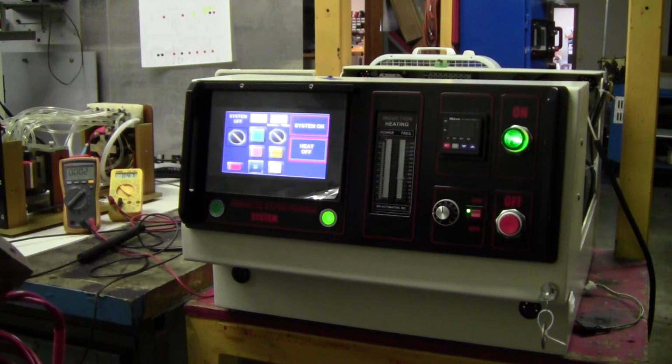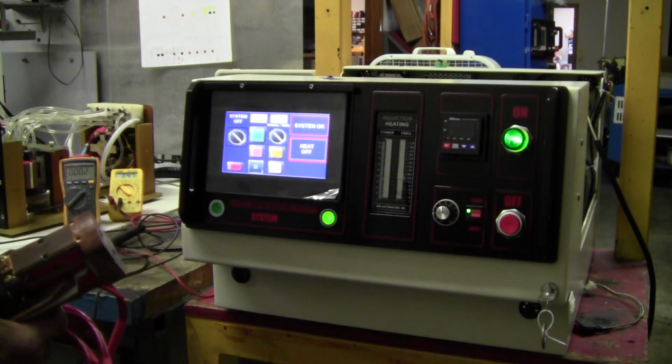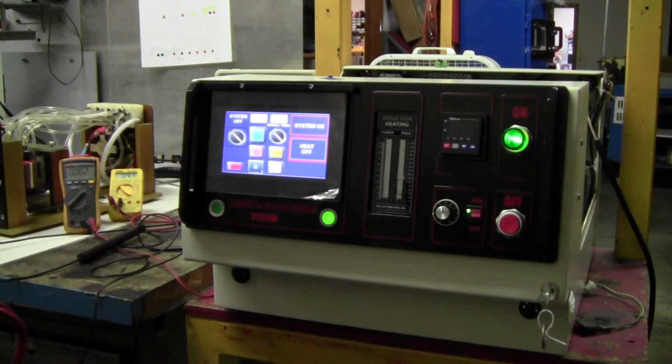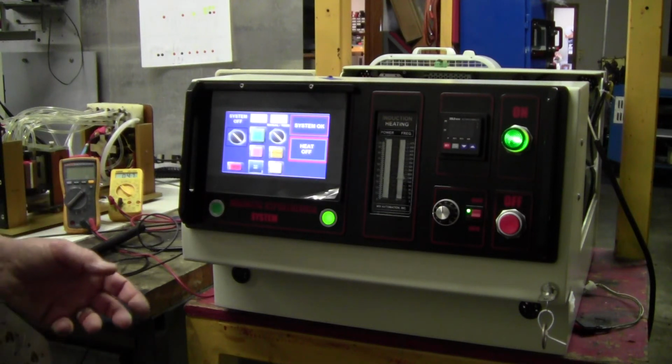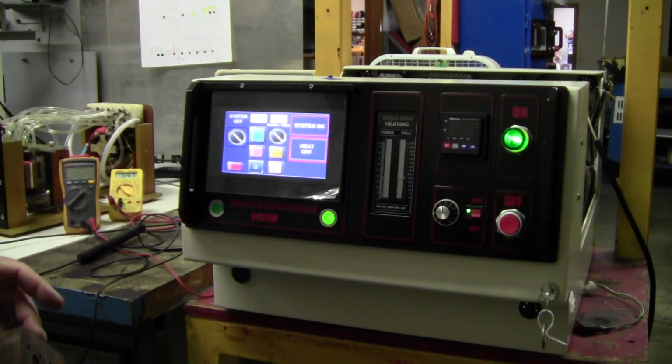The purpose of the hand unit, think of it this way. All the research that's being done is on animals. And what is the limitation on the research? Well, the limitation is the biggest animal that you can fit and treat with a heating coil is the one that can fit inside the diameter of the coil. So right now we have a 100 millimeter coil. So that's good for a rabbit, rat, small dog. But that's not a human, okay?